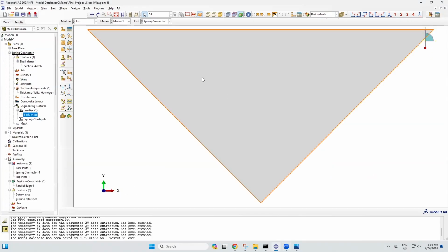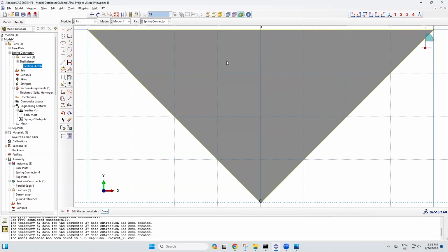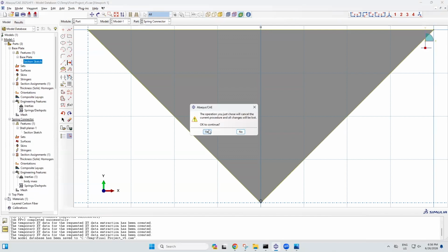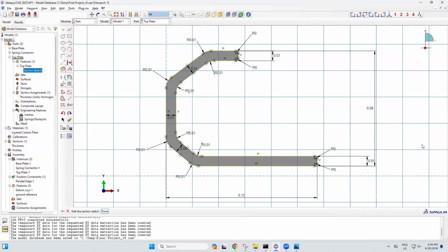The different parts I used were a spring connector, the base plate, and the top plate. For the spring connector, you can see that it is just a regular triangle. The base plate is a total length of 25 centimeters and an overall height of 2 centimeters. The top plate has an overall length of 12 centimeters and an overall height of 8.75 centimeters. Overall, all of these parts have a thickness of 7.5 millimeters and an overall height of 10.75 centimeters.